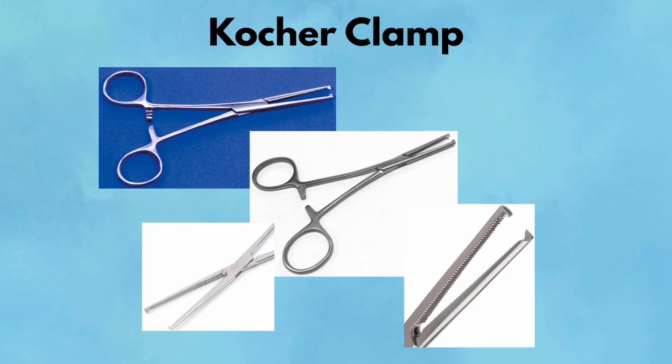Pearl: Kocher clamps are ideal when fascia needs to be controlled or bleeding must be stopped fast. Pitfall: Those teeth can do serious damage — never use them on bowel, vessels, or nerves.